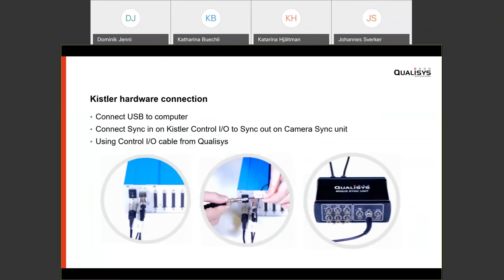The Kistler hardware integration is fairly simple. You connect the DAQ box to the computer via USB, and then you need a cable to connect sync out from the camera to sync in on the Kistler system — and that's all the hardware you need.